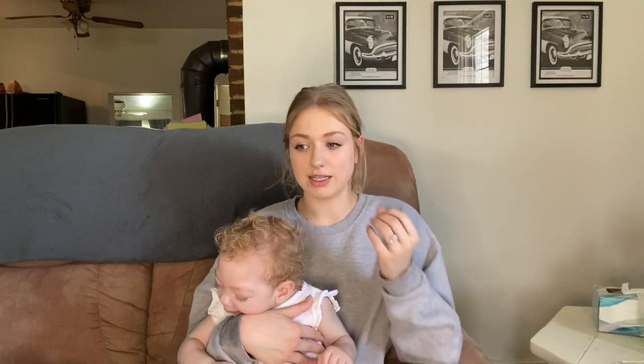Another question: why does she sometimes take a bottle and sometimes use the tube? It's completely up to Kendall. If she doesn't want to eat or won't finish a bottle during a feed, we'll just put the rest through the G-tube. If she's sleeping and didn't sleep well the night before, I'll just put it in the G-tube.